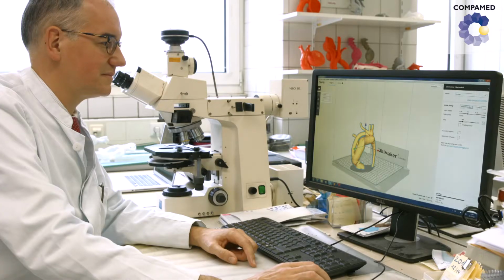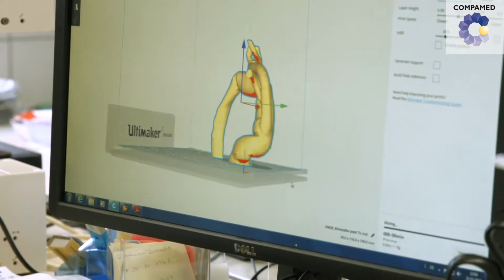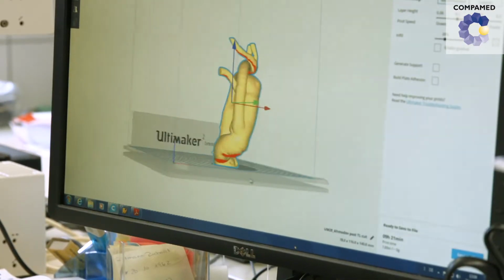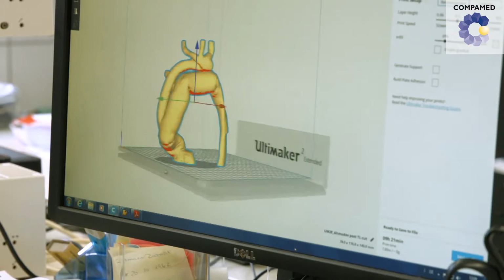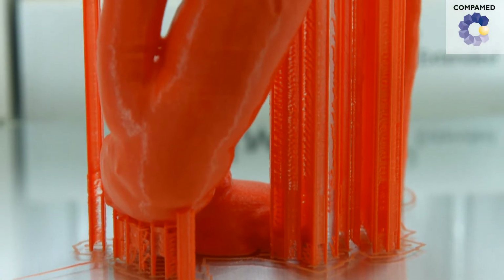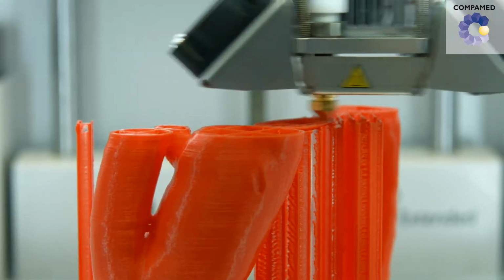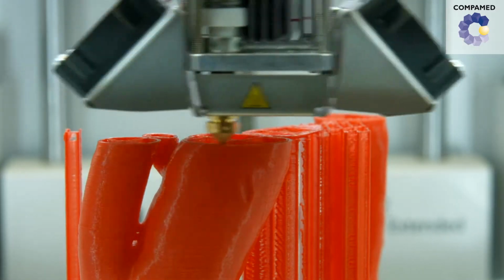The template for this type of 3D model is made up of imaging data provided by CT angiography. Physicians use it to determine the structure they wish to print. However, this method cannot be used for all patients yet, since the printing process takes some time. We currently use this process for complex cases, that being patients suffering from complicated diseases or complex vascular anomalies.